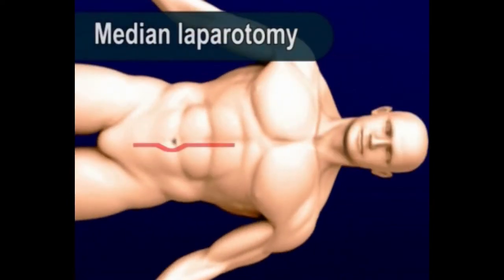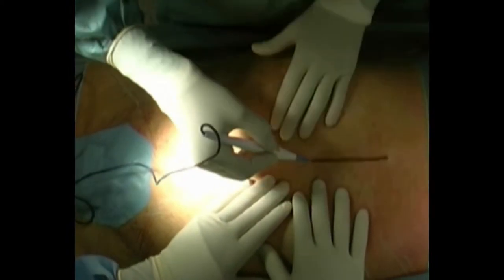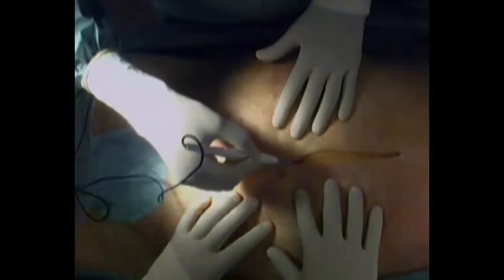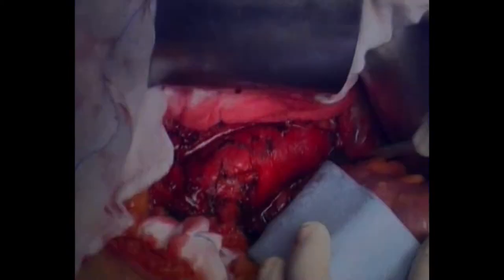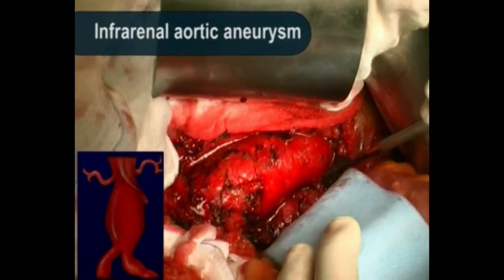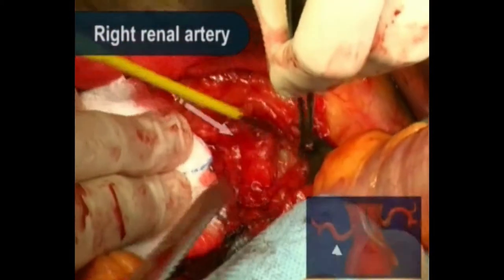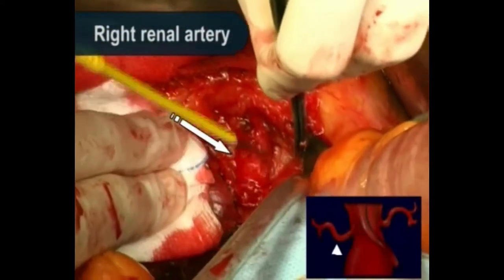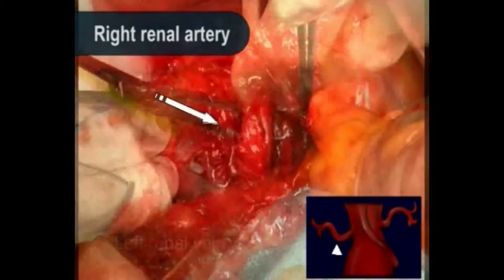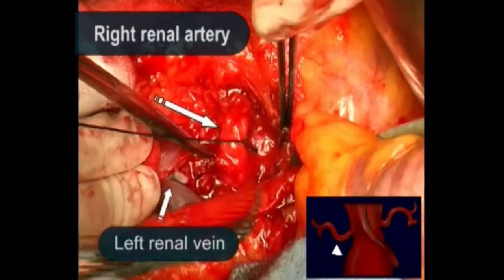Through a median laparotomy and a transperitoneal access, the infrarenal aorta was prepared. Both renal arteries and the SMA are isolated at their origin after mobilizing the left renal artery.